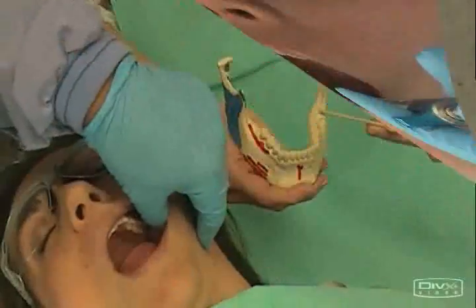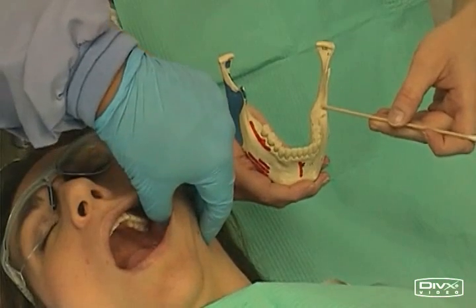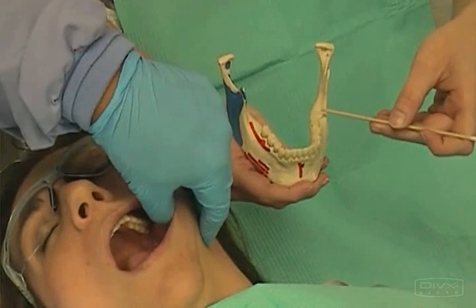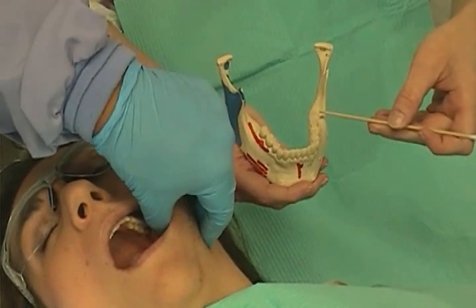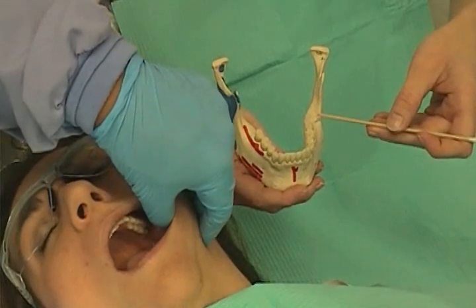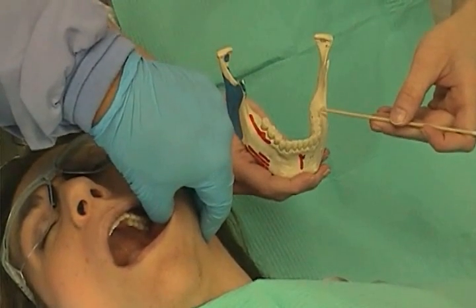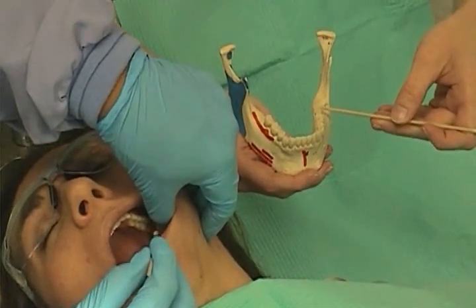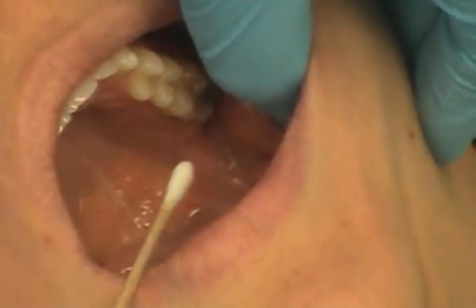I'd like to demonstrate an alternate approach to the inferior alveolar that is sometimes necessary due to differences in anatomy. The most important part here is to detect digitally the area back in here so that you can insert the needle in the least traumatic way. This necessitates entering the target site from the ipsilateral side, as opposed to the contralateral side, which you would do when you encounter normal anatomy.